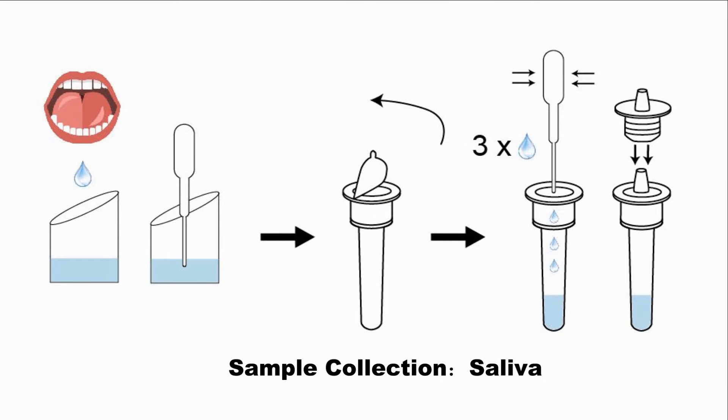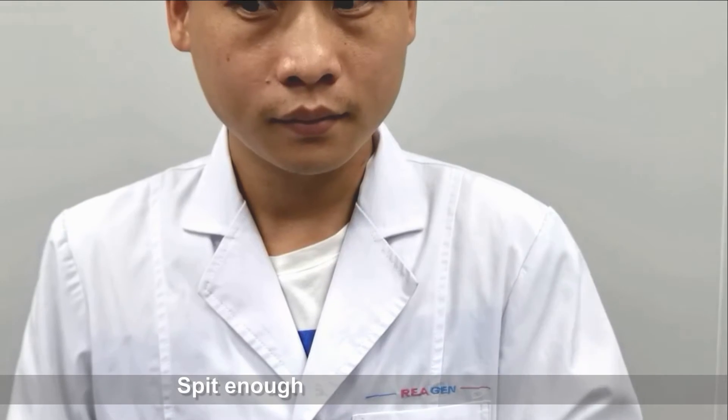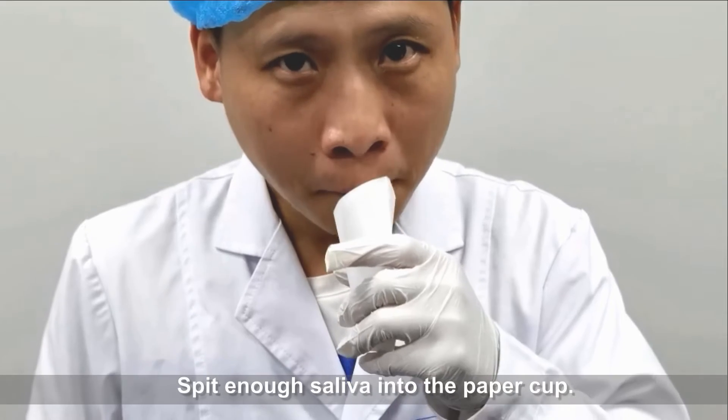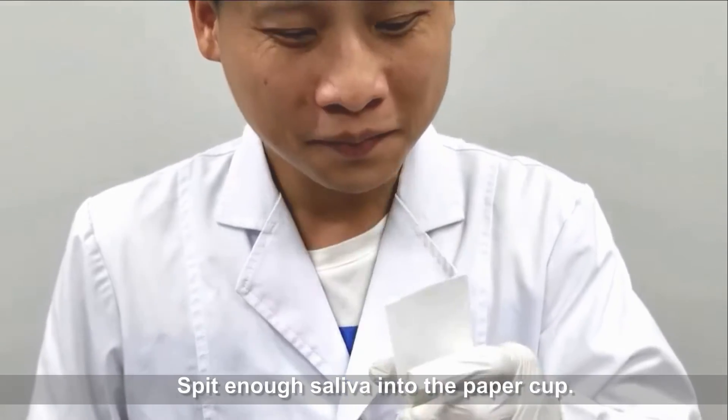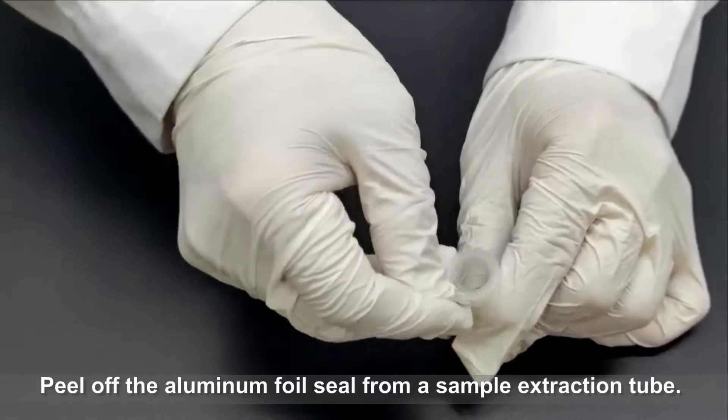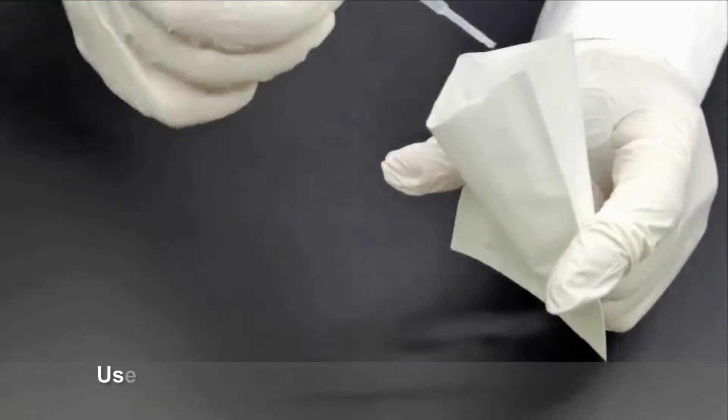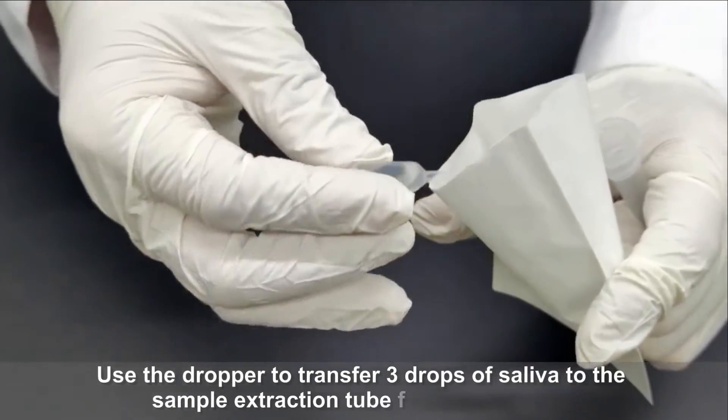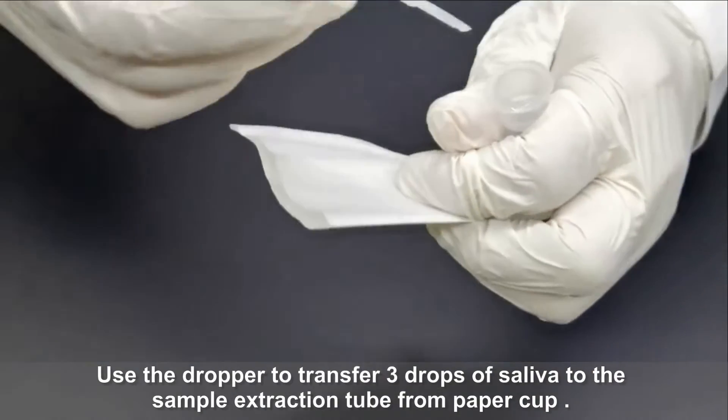Sample collection saliva: Spit enough saliva into the paper cup. Peel off the aluminum foil seal from a sample extraction tube. Use the dropper to transfer three drops of saliva to the sample extraction tube from paper cup.